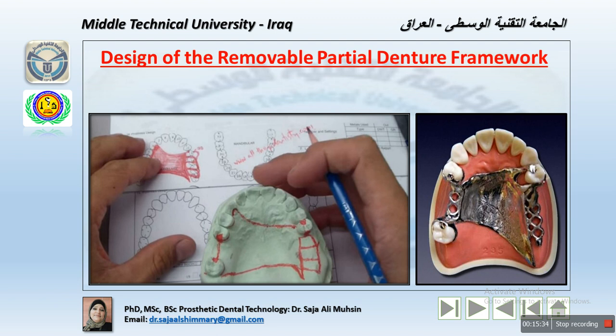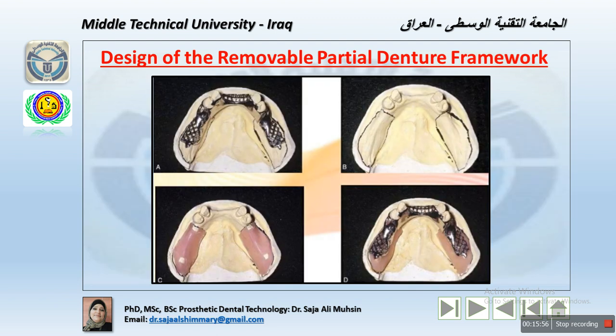It must be remembered that the extent to which abutments are subjected to rotational and torquing forces that result from masticatory function is directly related to the position and resistance of the food bolus. Okay, now the greatest movement takes place at the most posterior extent of the denture base. So the design is affected by these factors.